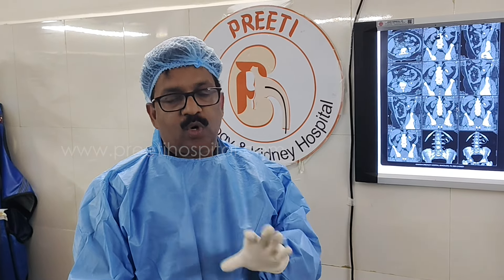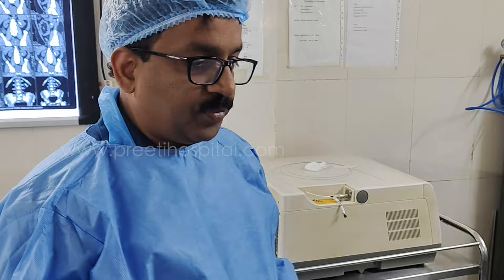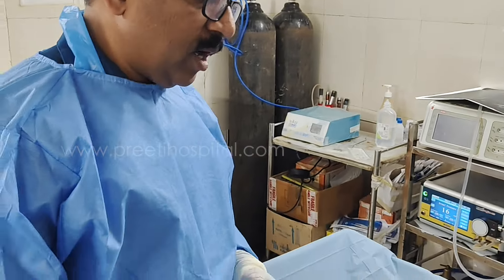The patient is stented and came from another state only for RIRS. I told them already that PCNL is easy, but they want only RIRS. It is their choice. Sometimes a patient may not go for the scientific choice, but we have to assess feasibility. Because it is feasible, I thought I will attempt the RIRS.